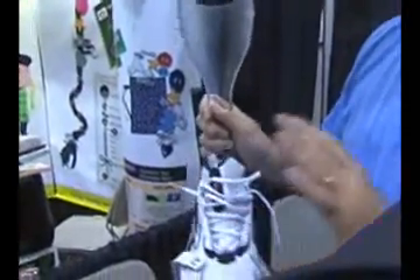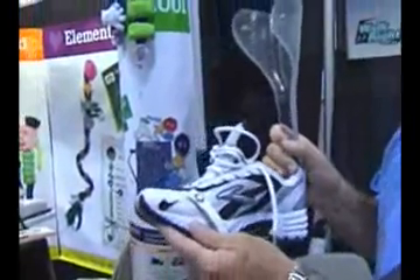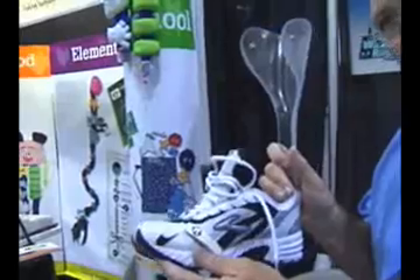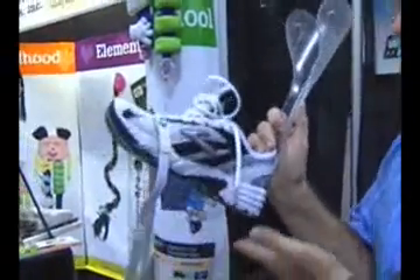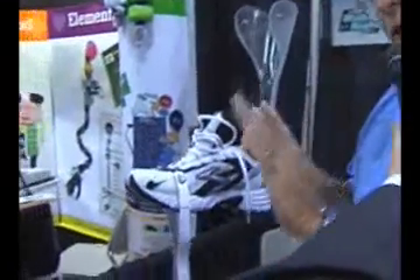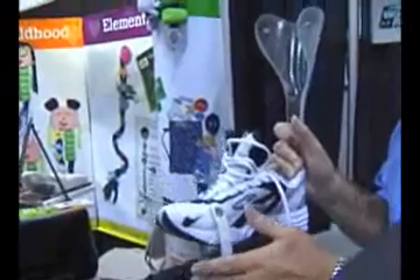The elastic straps that attach to the top of the brace serve a number of purposes. The first thing they do is bring the toe up past the neutral position. This allows the individual to place the heel of their foot down on the ground first, walking in a normal gait — first the heel, then the ball of the foot. The elastic straps also serve to decelerate the foot so it doesn't slap the ground when they're walking.